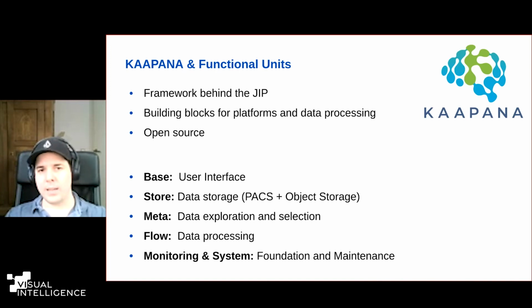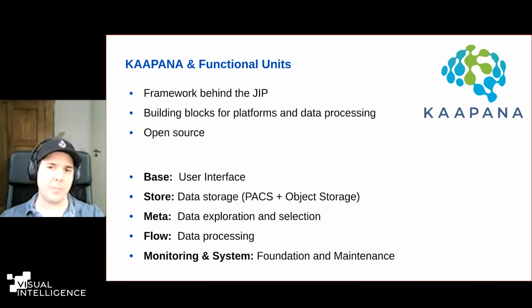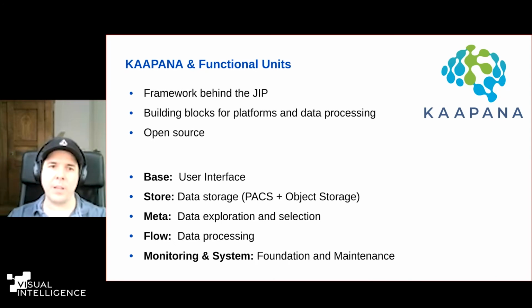And you can use this framework to build project-specific platforms. That's what it's meant for. So if a project has very specific demands, so it needs a special software or something, it can be built in a way with Kaapana that you have your project-specific platform. And that's what we're currently developing, and which is also already on GitHub.